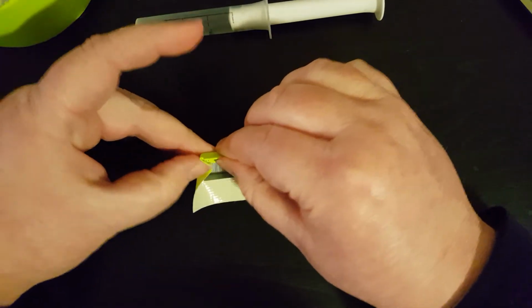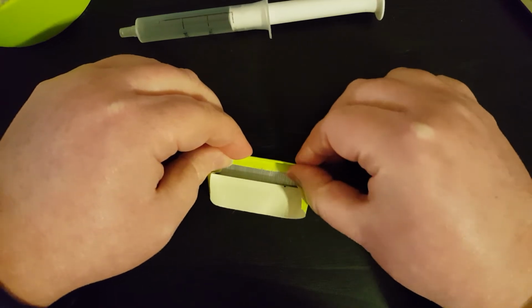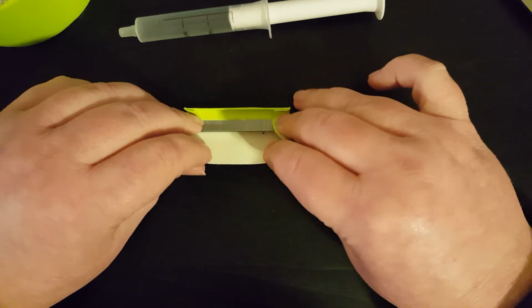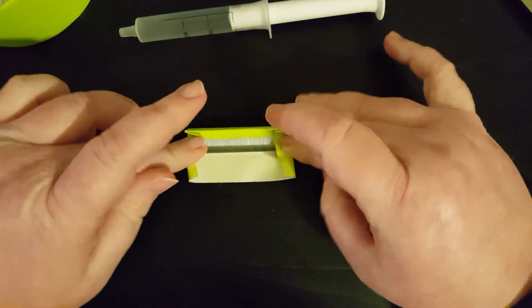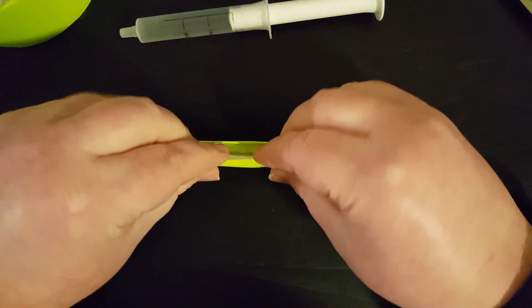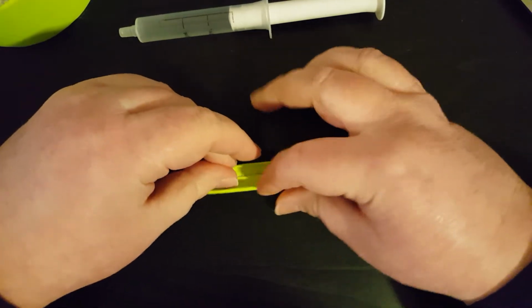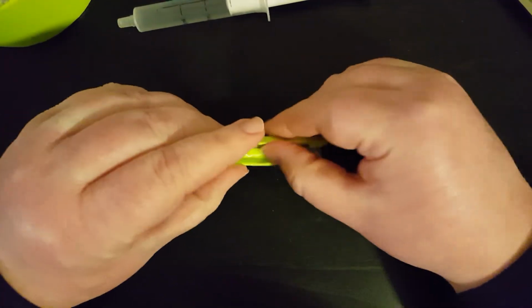But you're just going to make sure that your staples are wrapped nice and snug. And I might even need to cut on it, but for this video, I'm not going to do that. Okay, so I have wrapped the staples.